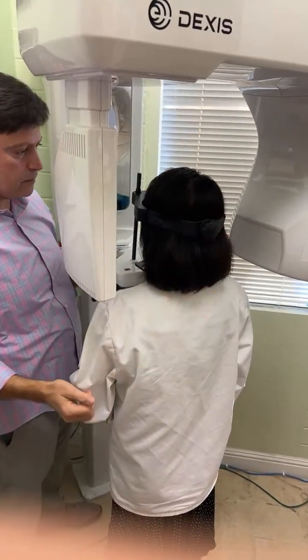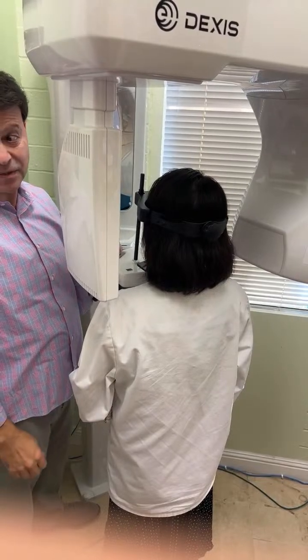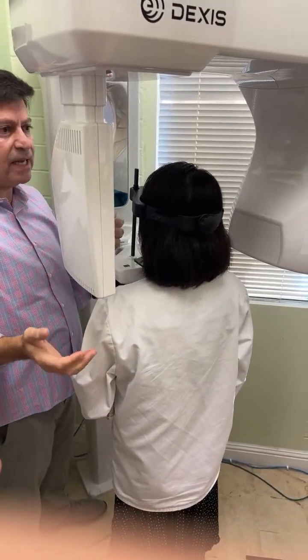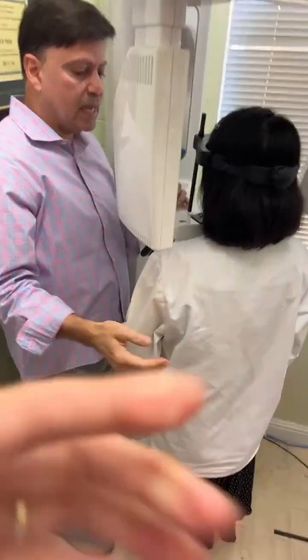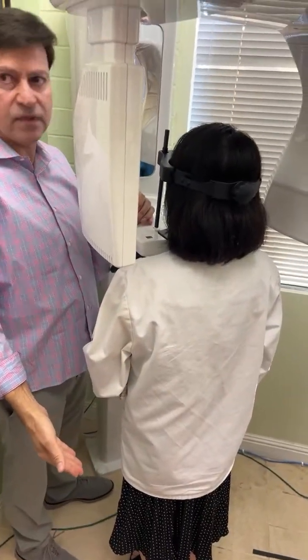Feel pretty secure? Yeah. See? It's pretty secure. If you have somebody who's elderly and can't stay still and they're kind of shaking or they breathe heavily and they're moving, sit them down. Do everything as if they're standing.